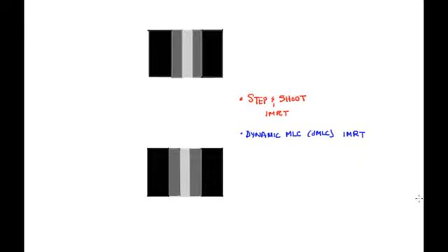All right, so there's another form of IMRT that you need to be aware of, and that's called volumetric modulated arc therapy, or VMAT. That's the vendor-neutral term. You'll sometimes hear it called RapidArc. That's a variant trade name, but the generic term is VMAT. It's a different delivery technique, but the goal is the same, to deliver modulated dose. So sometimes it can even be lumped in with IMRT.